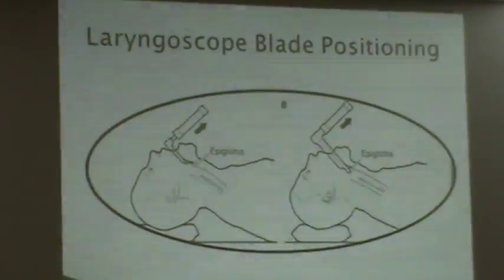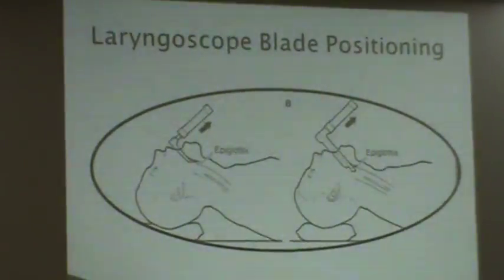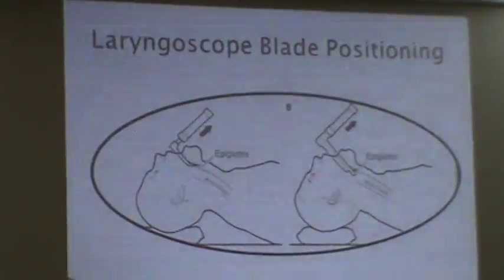With the straight blade, some people like to go a little bit deeper and then slide back until the airway slides into view and drops into view.